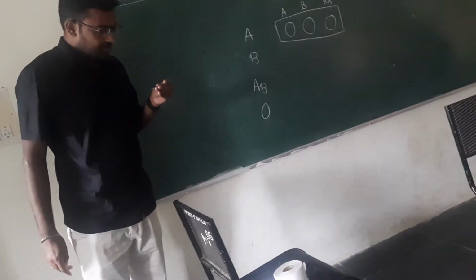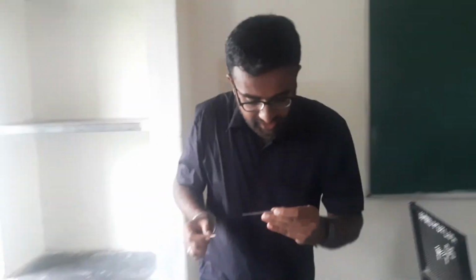There is no clotting in A, so it is not A blood group.